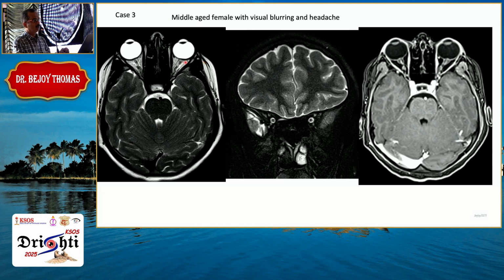In this case, when you look first, you can see the perioptic nerve sheath fluid is prominent, and there is also a horizontal buckling of the optic nerve. If you are very careful, you can see there is a posterior scleral flattening, which you have already diagnosed on fundus examination of the optic nerve as a raised ICP feature. Again, we can't see through an indirect ophthalmoscope. What we can see is the globe as such. You can see there is a posterior scleral flattening, and if you give contrast, you can see that the optic nerve head is bulging in and also showing enhancement.